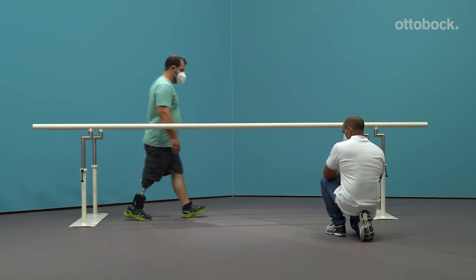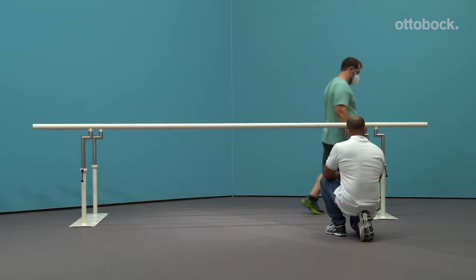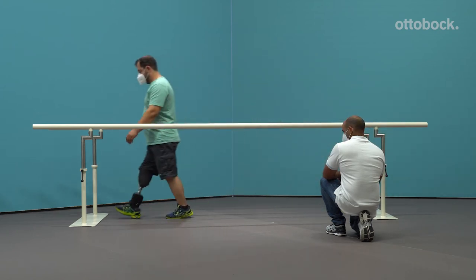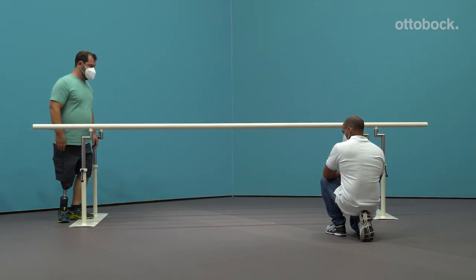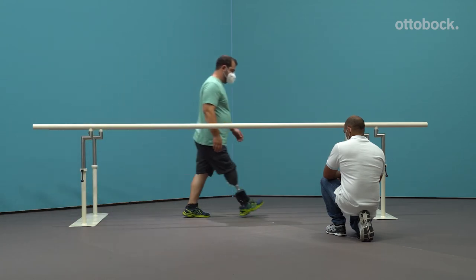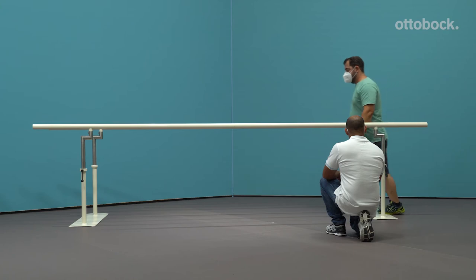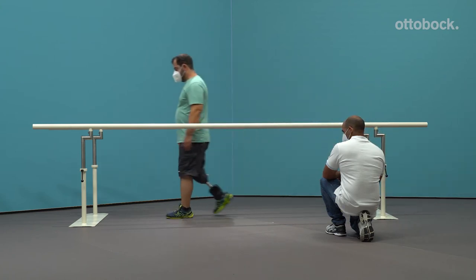Therefore, please check the following points. Is there too much knee flexion during load transfer? If yes, move the prosthetic foot in the anterior direction and/or use a softer heel wedge. The powered push-off at toe-off will be triggered earlier as well as intensified.